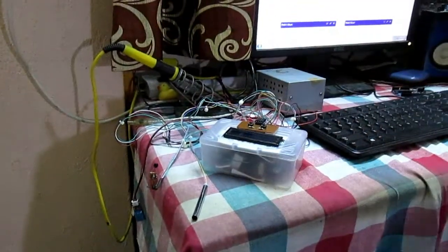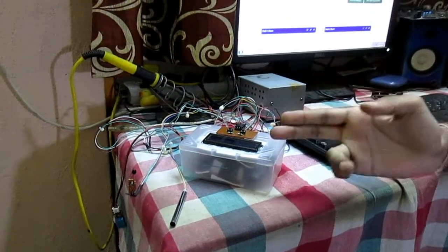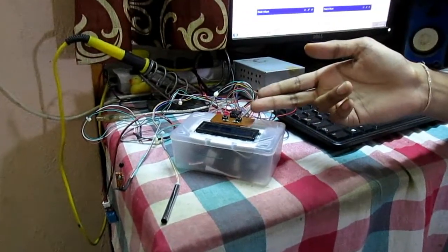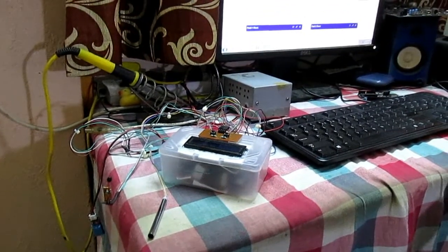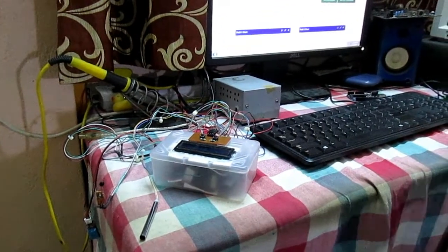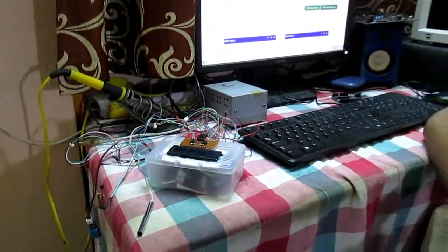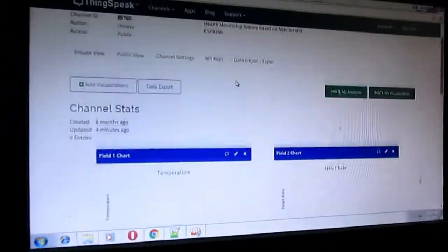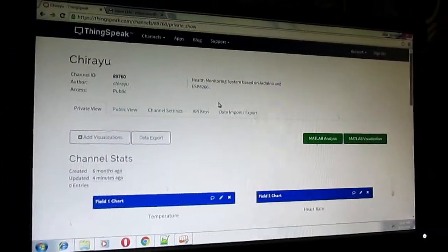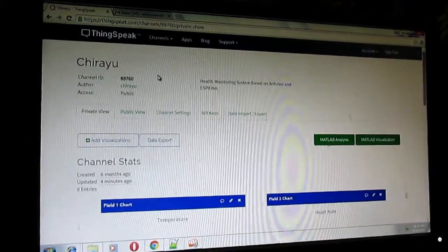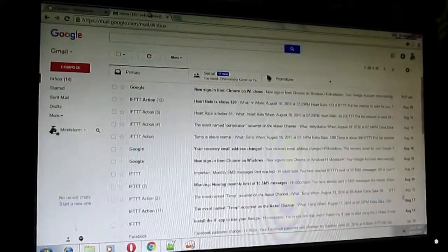For a good user interface we use an LCD display and switches. We use Arduino as a microcontroller and ESP8266 as a Wi-Fi module. We are transmitting the data to ThingSpeak, and whenever the data goes above or below the normal range it will send an alert message to our Gmail.